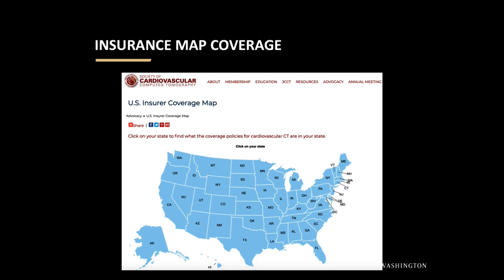I don't know if you have... There's one other interesting comment. If you think our insurance is really screwed up, here's yet another instance. If you order a calcium score followed by a CT angiogram, because the calcium score is in many ways considered experimental, both the calcium score and the CTA are considered experimental, so they won't pay you. New York University actually figured that out when 6 months of CTAs were not paid for.